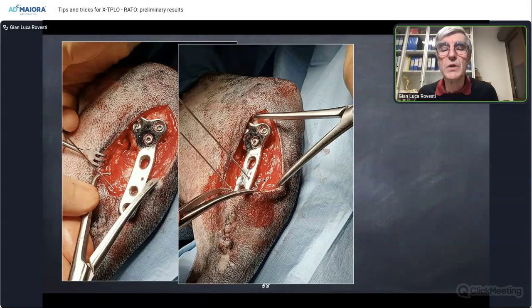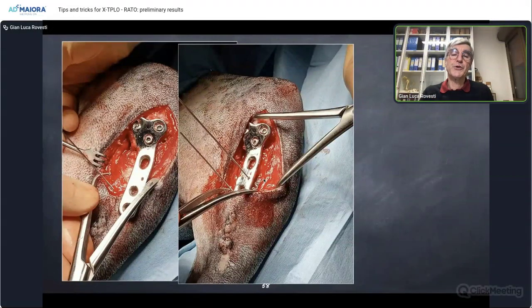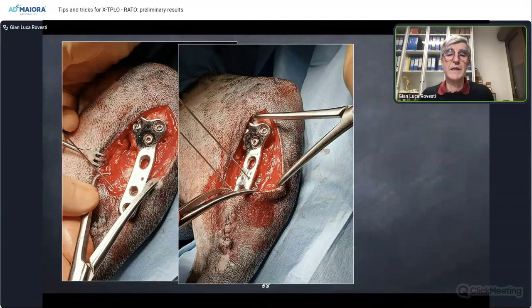In this position, the plate is aligned correctly, and if we measured correctly, we should have also achieved the rotation needed to reduce the TPA to the scheduled amount of degrees. It is important that this K-wire will hold the plate very flat on the tibia.